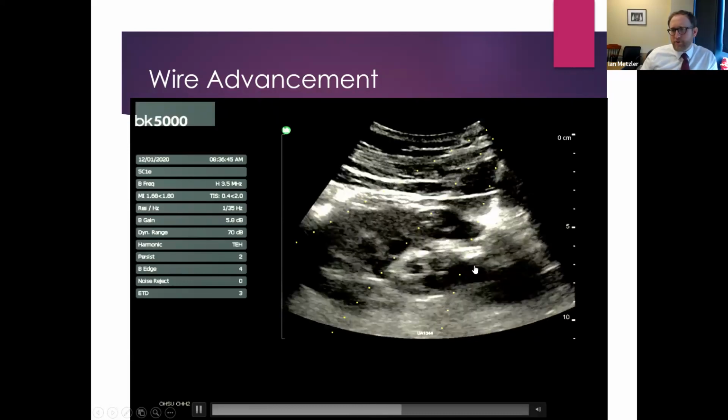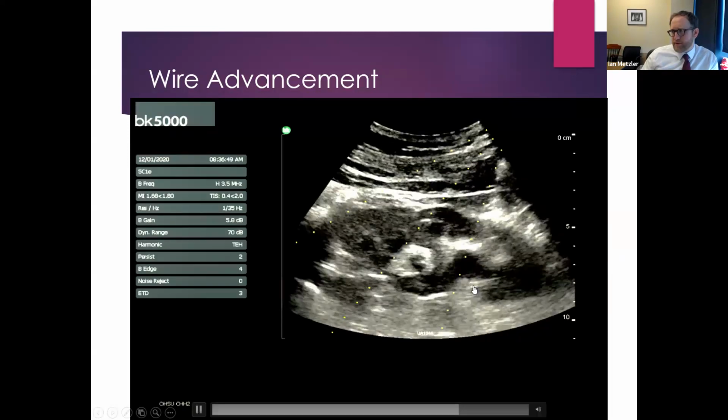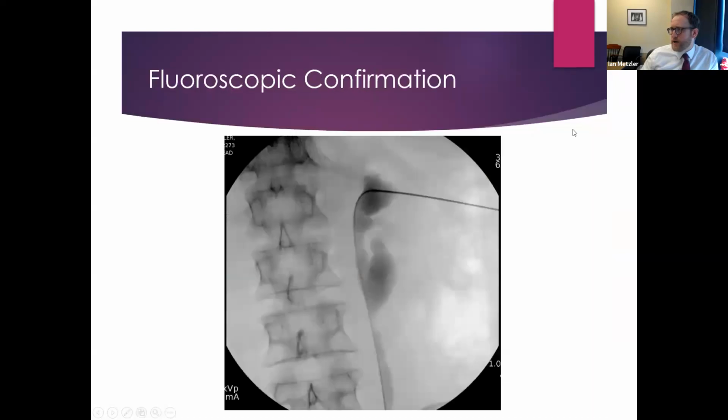So you can do that portion under ultrasound, but obviously, under fluoroscopy, it can be a little bit clearer. So that's why I still use fluoroscopy in my operating room. But it takes multiple fluoroscopy exposures to get your needle in place, and you save all of that by using ultrasound, and instead can just take a single shot to confirm your wire placement and possibly do a retrograde. So even if you're not entirely using ultrasound, which most people do not, and I still use fluoroscopy quite a bit, especially for the dilation portion, because the ultrasound imaging of the balloon dilators is not the best, because they're very not echoic. Fluoroscopy can still be useful, but you cut down on all the exposure that you give to yourself and the patient and your colleagues in the room by getting that initial needle puncture access.